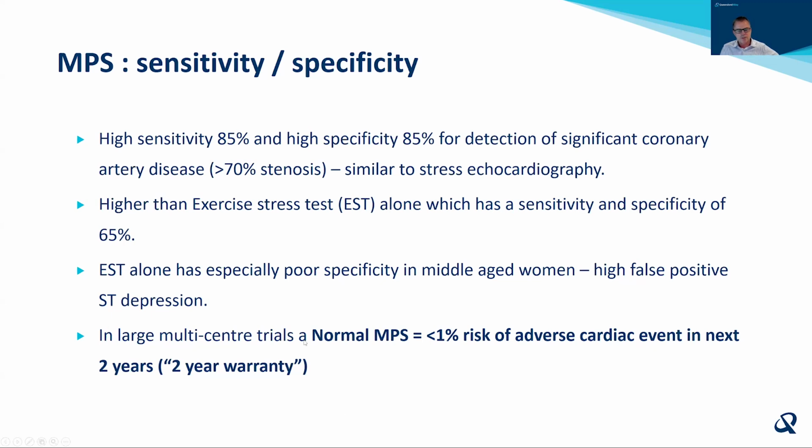Now, in very large historical multi-center trials, a normal MPS was proven to have less than 1% risk of adverse cardiac events in the next 2 years. So basically, a normal MPS gives the patient a 2-year warranty.